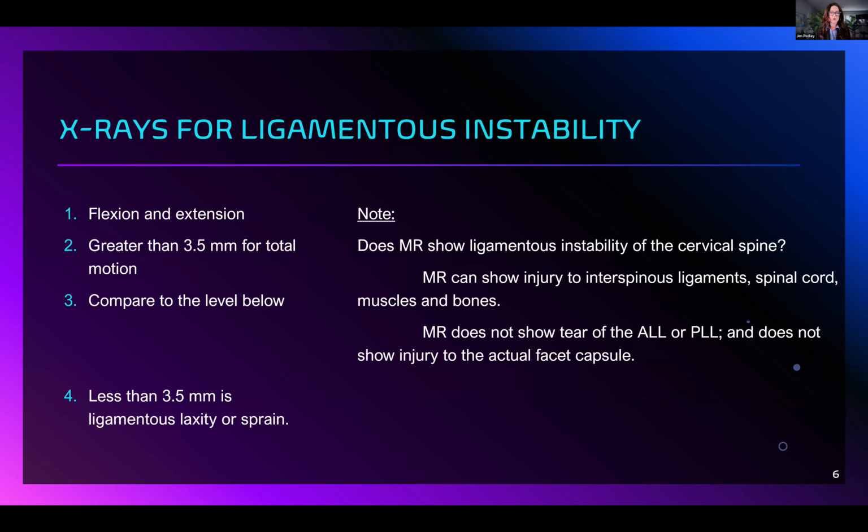And some ligaments are a little bit special on MRI. The reason I say special is because it doesn't show high signal, and we cannot see those tears on MRI. I have attorneys out there that say, I really don't need X-rays. But we're losing information in proving that there is ligamentous instability or ligament injury. And the flexion-extension X-rays are extremely important.